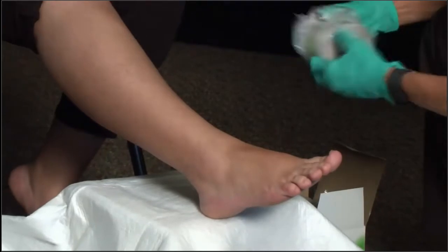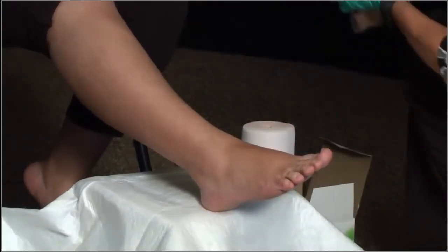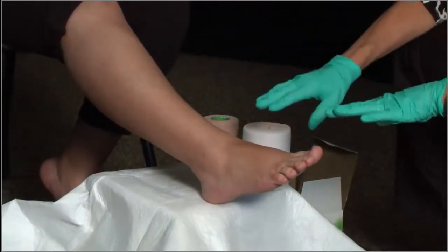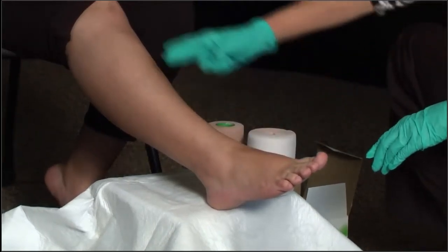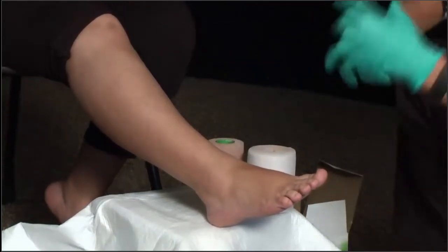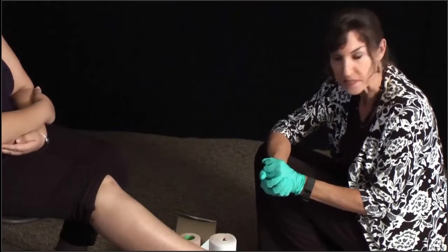I'm going to go ahead and just remove these from their protective wraps. When we are applying compression to these patients, we are going from the base of the toe all the way up to just below the tibial prominence. The idea behind this is it's creating that counter pressure to help restore venous return back to the heart.